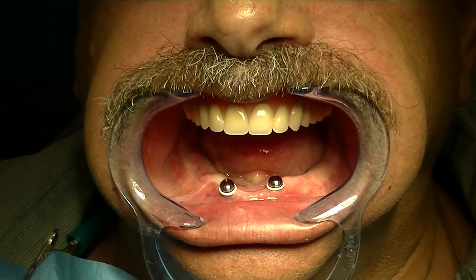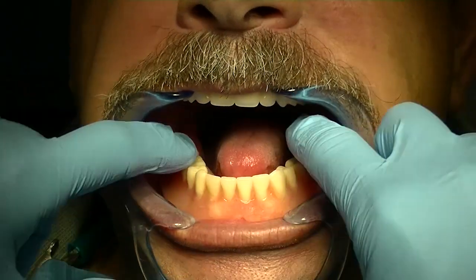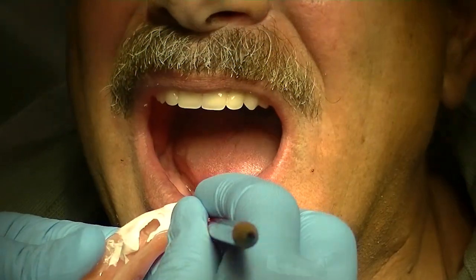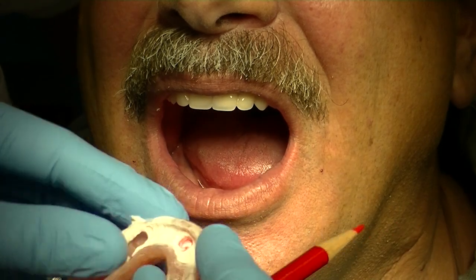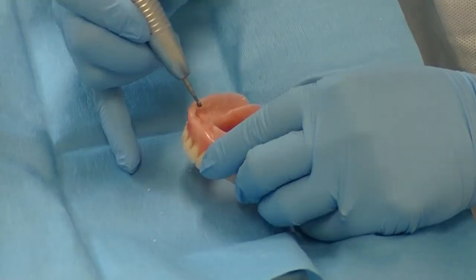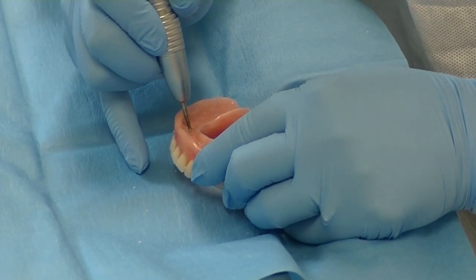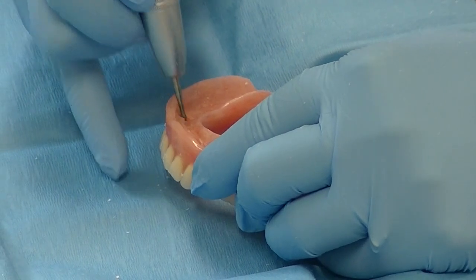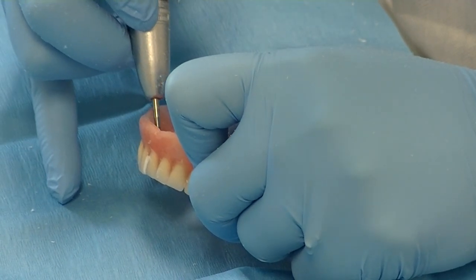I like to use a fit indicating paste, a PVS type material, inserting it into the intaglio recessed area of the complete denture with finger pressure. We're moving it carefully and marking any areas of show-through where I'm seeing the denture showing through on the fit checking material. At this point, we're creating mechanical undercuts using a round bur. The chair side material works best when you use a mechanical undercut as well as a vent hole on the lingual slopes of the complete denture, very easily placed with a number six or number eight round bur.